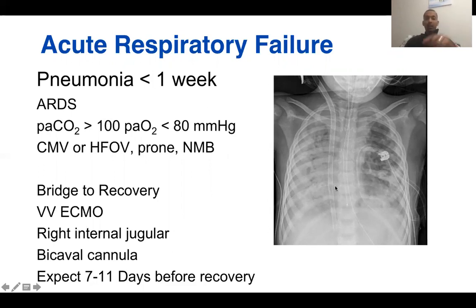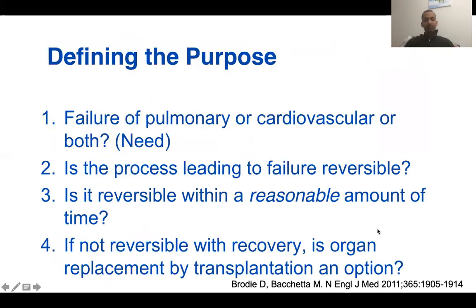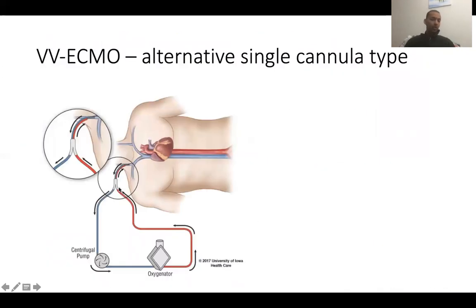Okay, and that will be actually the return cannula, or the returning port, returning catheter, that's aimed exactly at the tricuspid valve. Okay, and that is what is being shown here: the returning blood goes through the right atrium into the right ventricle and goes out back into the left side.